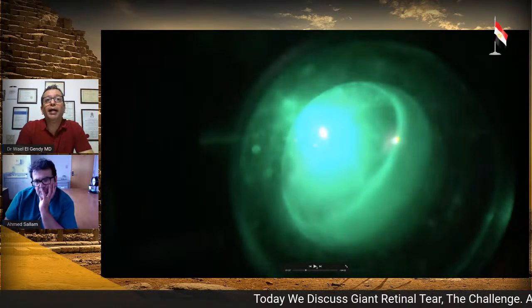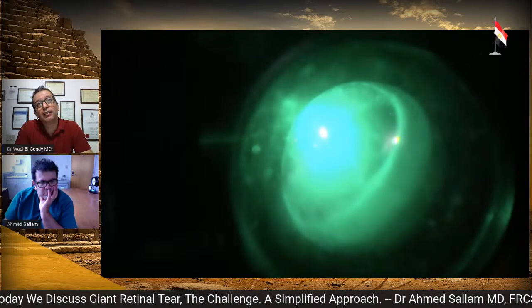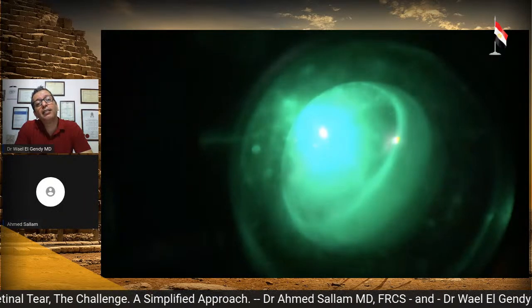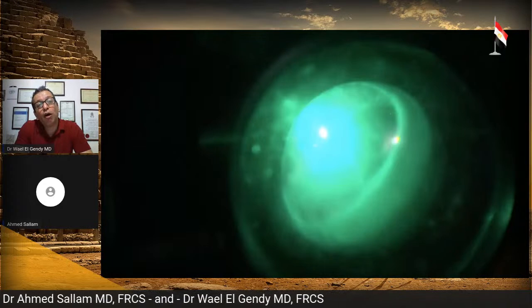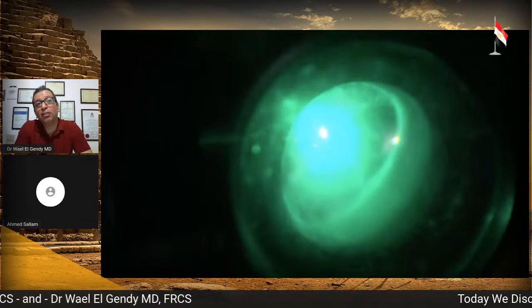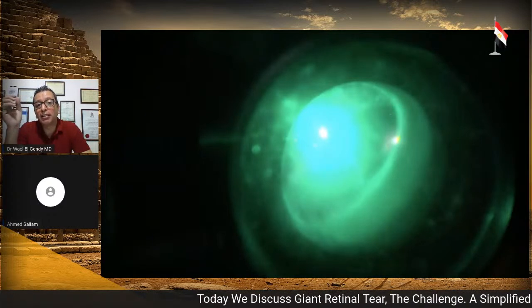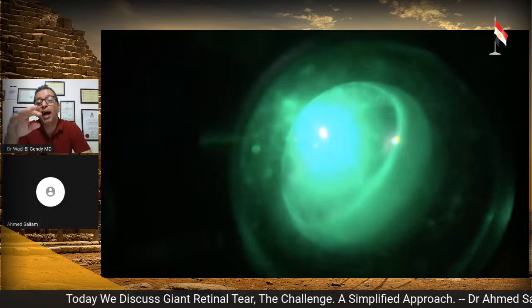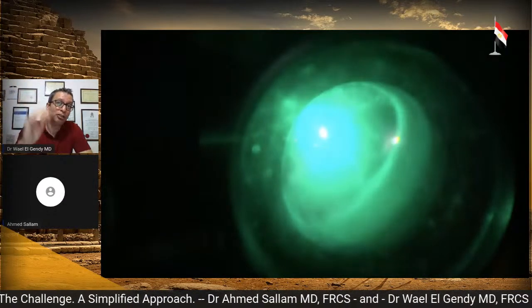Okay. So what I wanted to point out here in this diagram is the presence of fluid in this area. The horns are not 100% coapted. You have to keep in mind that you might have a small film of fluid under the retina, surrounding, above the PFC that you have.